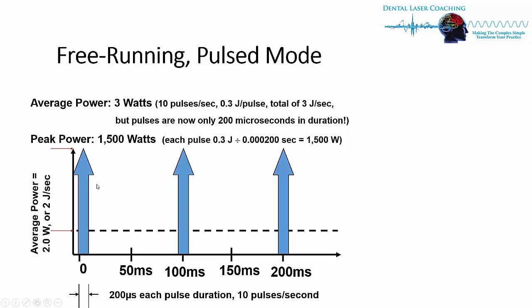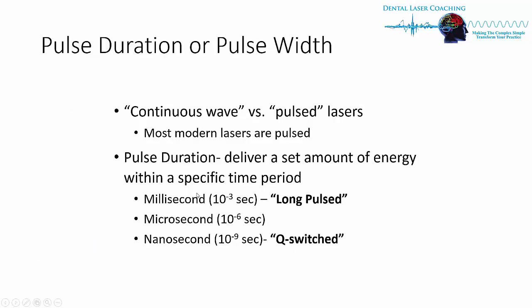When we can do this, it cuts much more efficiently and effectively, no matter what the technology, and there's less thermal damage when we can have it on for fractions of a second. And we can control how many pulses per second we want to do this, but this is just a graphical representation of some of these free running lasers.